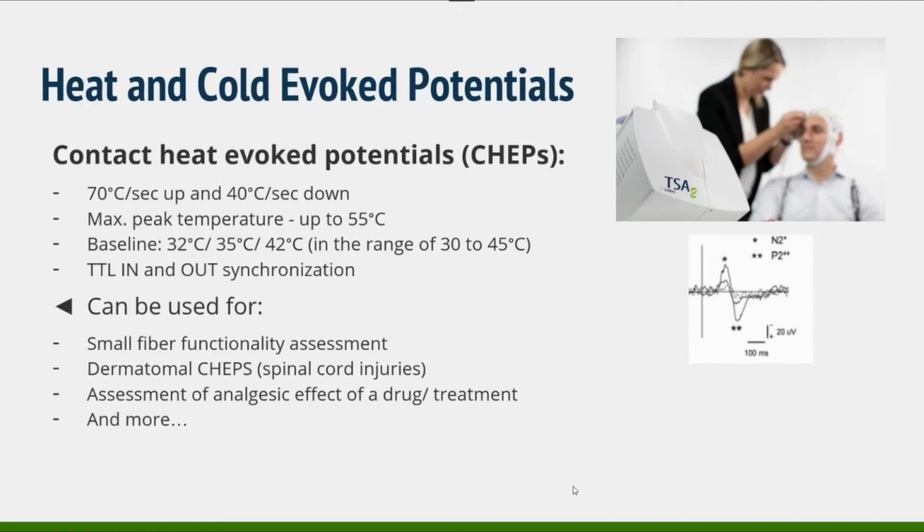We know that there is a technique introduced by a group in Switzerland, led by Professor Armin Kurt, that suggests that using the increased baseline will help to record evoked potentials from lower limb in elderly patients, cases in which recording can be a bit more challenging than just recording from the face or from the hand of a young subject or patient.